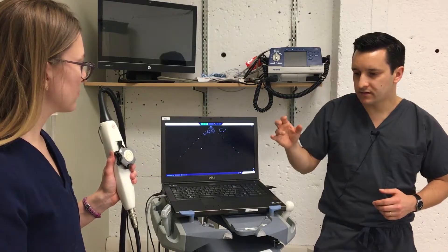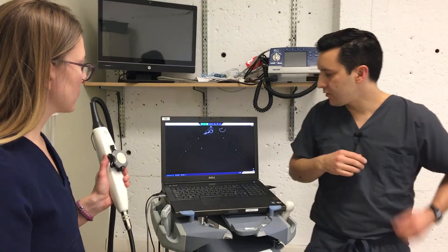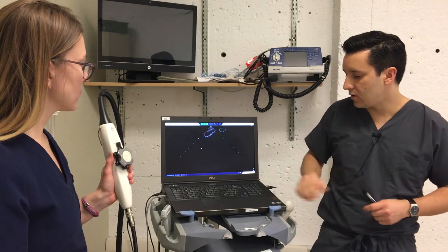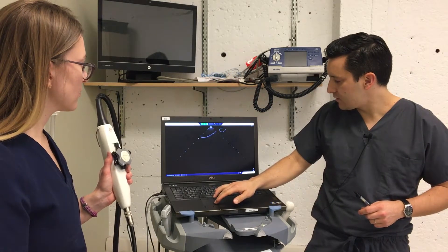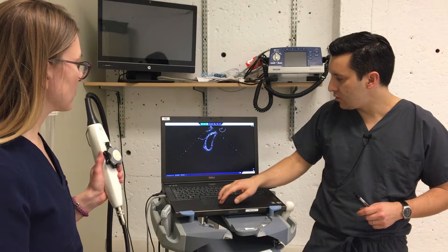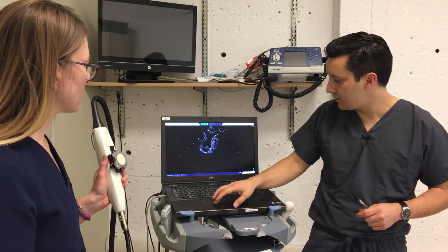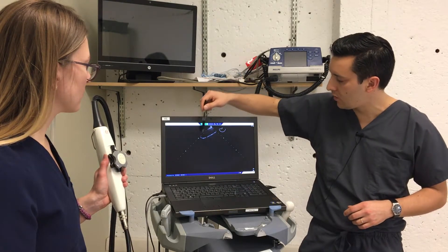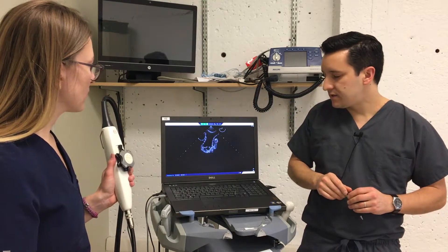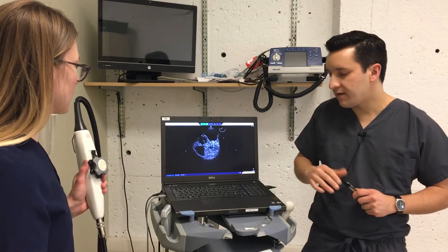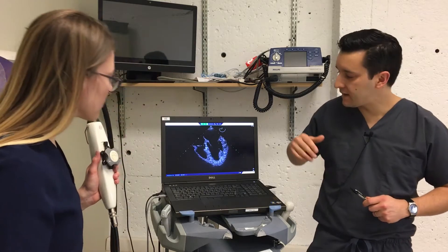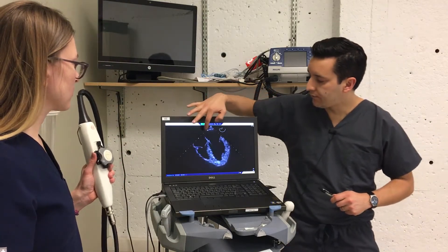As Dr. Zayden advances the probe into the esophagus, the first structures that you see are the brachiocephalic trunk, and as she continues to go down and further advance, she's going to encounter the mid-esophageal view of the aortic arch, as you can see in this image — a long axis view of the aortic arch. As she continues to go down, we're going to find roughly 30 centimeters from the mouth, in the mid-esophagus, our four-chamber view.